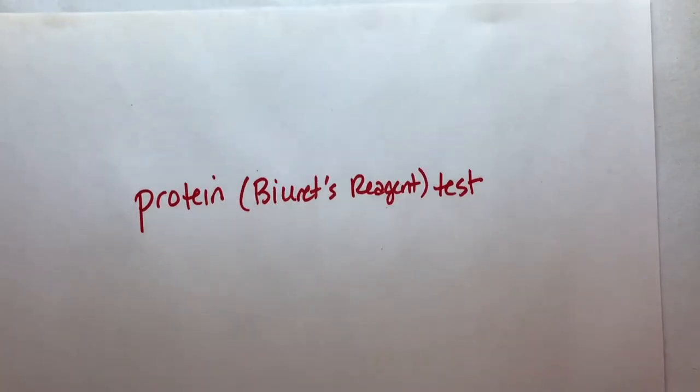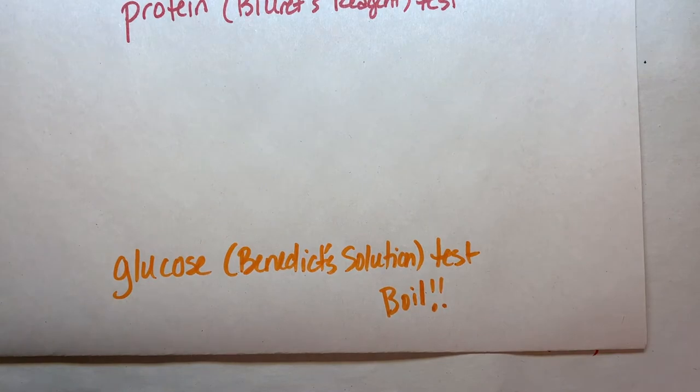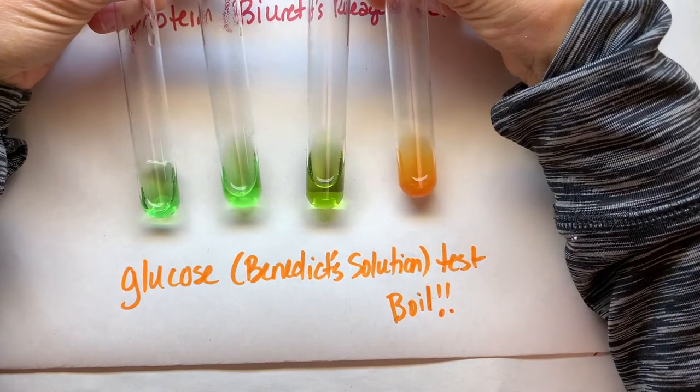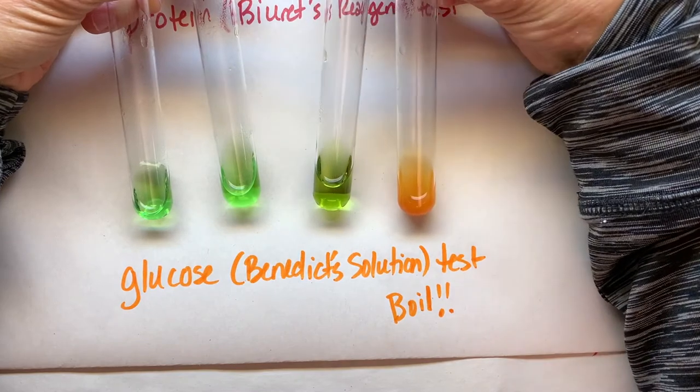Now let's look at Benedict's test. Here we have three negatives that are green and then one positive that is orange, kind of a yellowy orange.